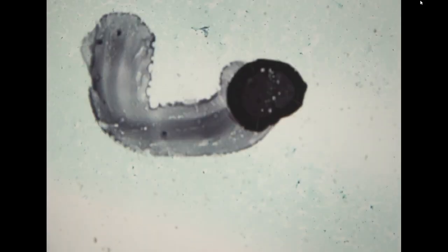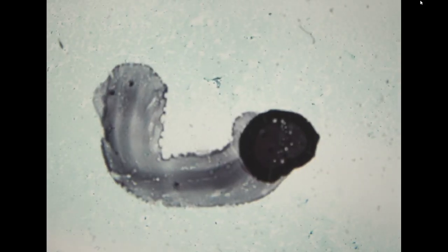The next specimen is from a 25-year-old male, from the pelvic bone. The patient is young, which is very unusual. The patient has multiple osteolytic bone lesions. The clinician suspects metastasis, but the patient is very, very young, which is kind of unusual.